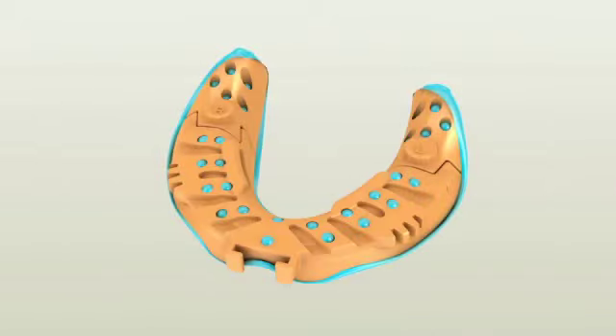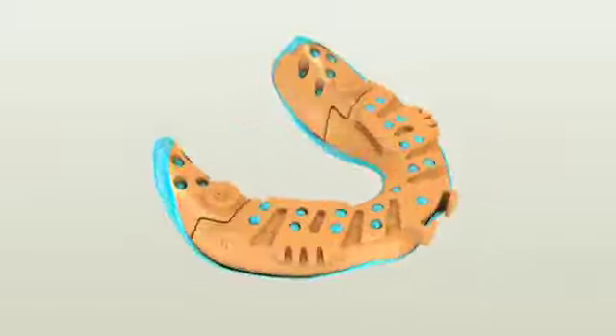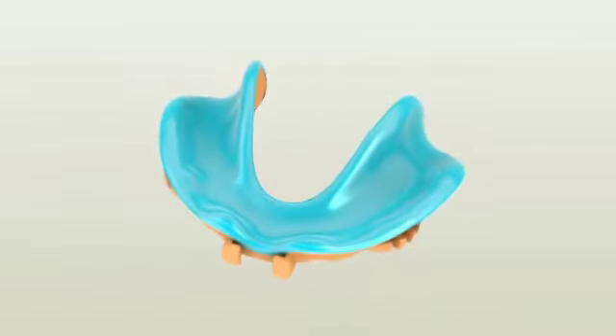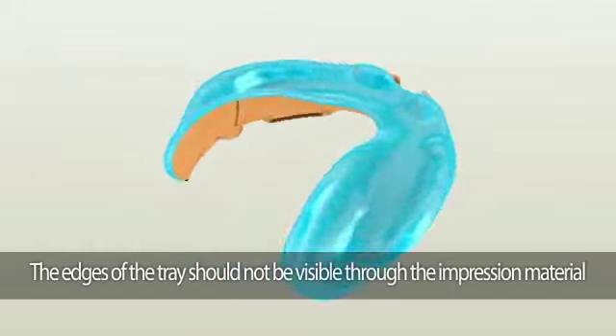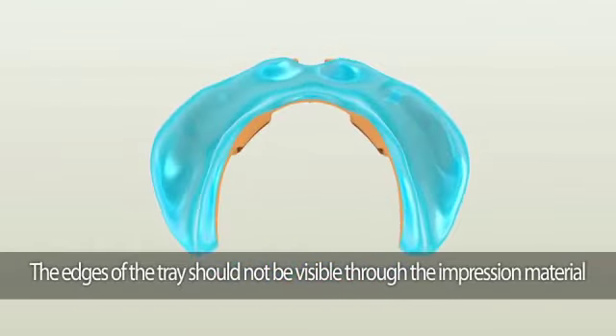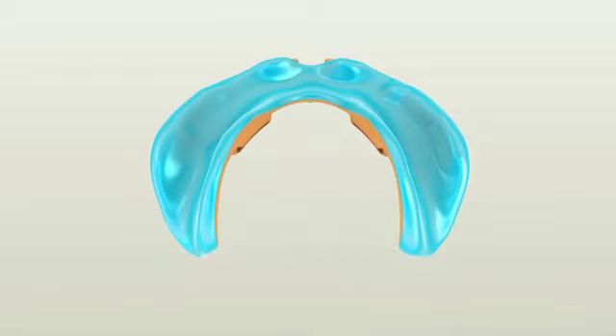Once the material is set, remove the tray and check the impression. There are two areas to check. One: the edges of the Pala digital denture tray should not be visible through the impression material. If you see any plastic edges through the material, it means the tray is touching the soft tissue. If it does, simply remove it using a slow-speed handpiece before taking the wash impression.